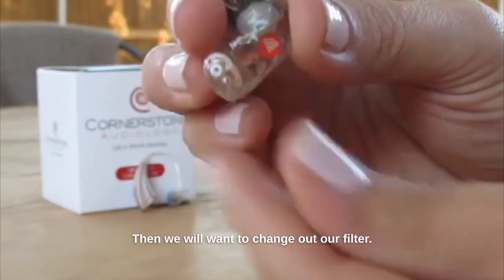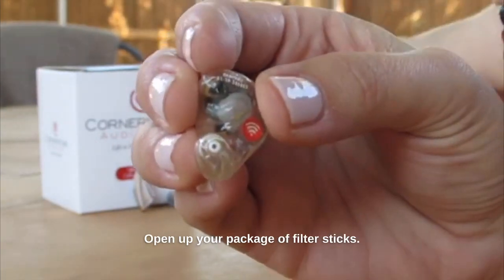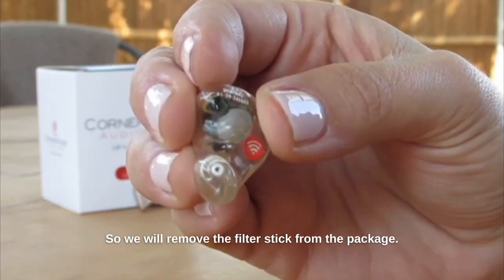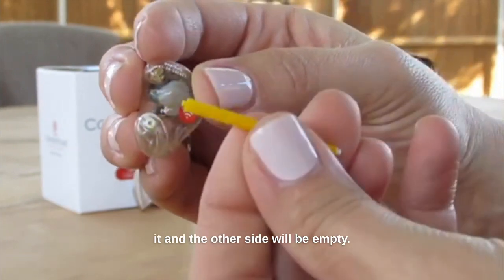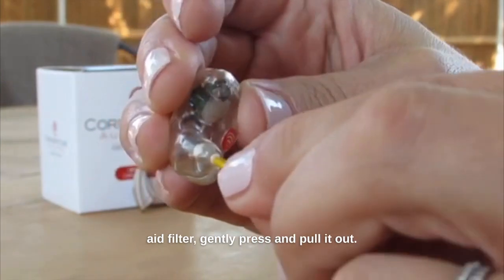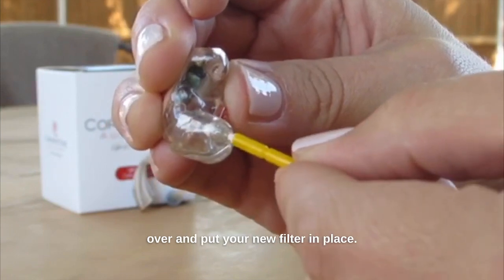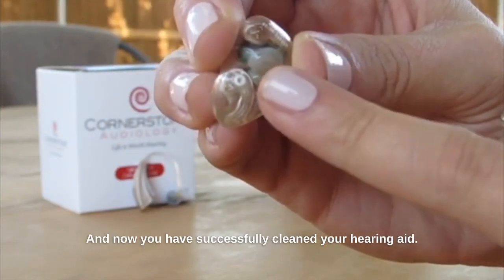Then we will want to change out our filter. So this little white dot here, this is your filter. Open up your package of filter sticks, they're yellow. So we will remove the filter stick from the package. One end will have a white filter on it, and the other side will be empty. We'll place the blank side into the hearing aid filter, gently press and pull it out, and then you're going to turn your filter stick over and put your new filter in place. And now you have successfully cleaned your hearing aid.